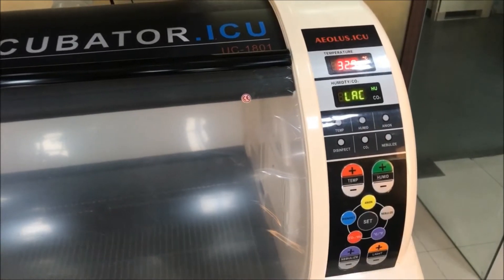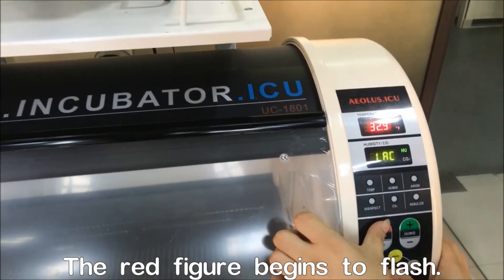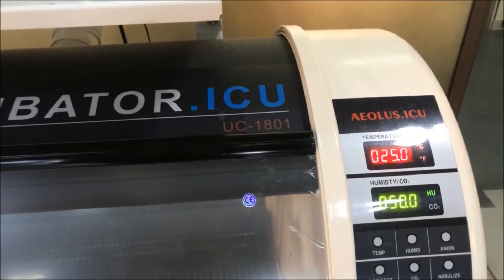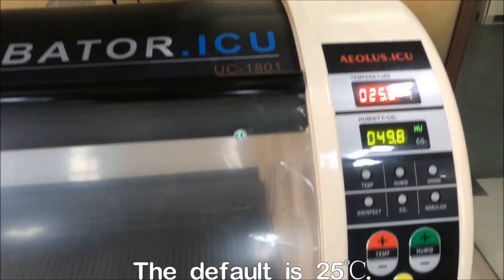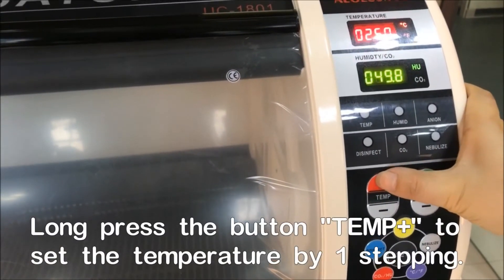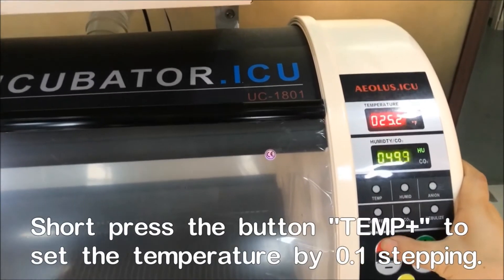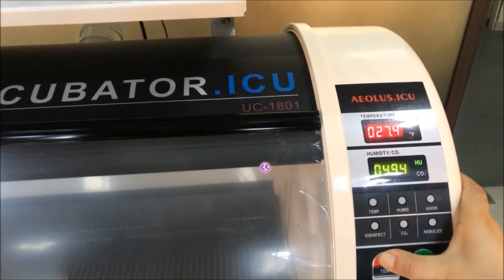Now you see the numbers blinking — the setting is at 25 Celsius degrees. Hold and press the plus button; the stepping is 0.1 degrees for each press. Hold it for a longer time and the stepping will be one degree each time.